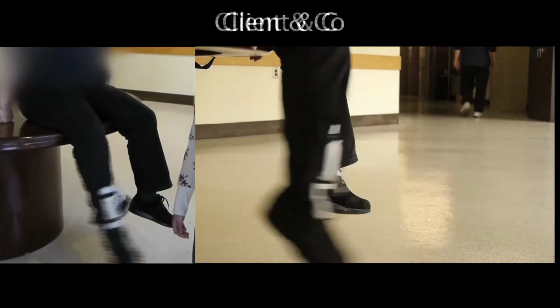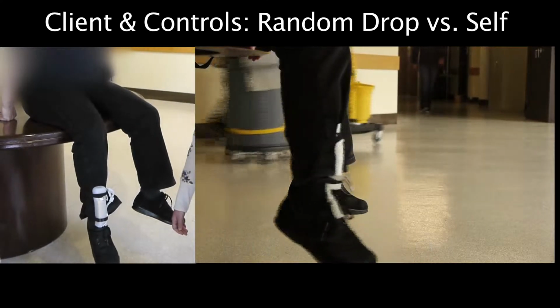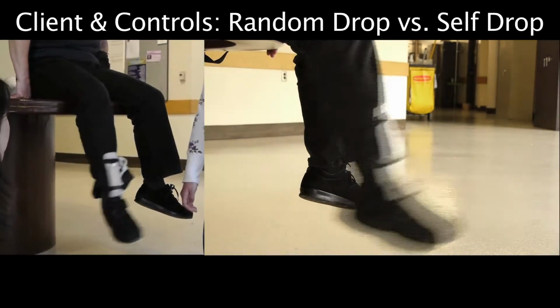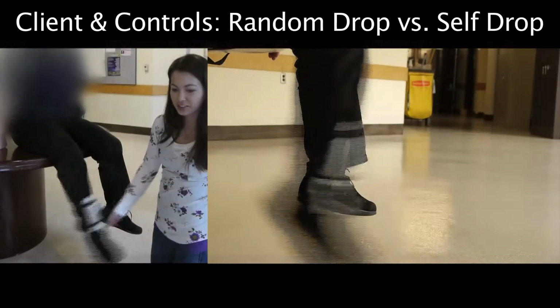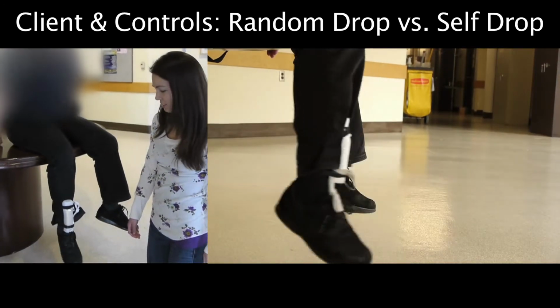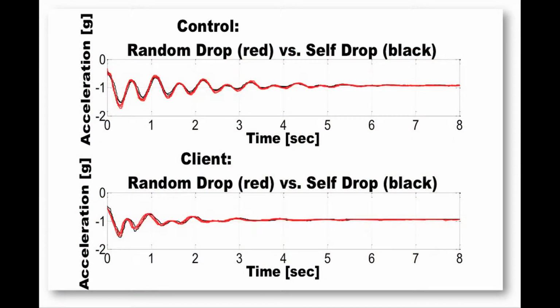Since one of the shortcomings of the pendulum test is that it requires a trained physician to randomize the drop and determine the patient's spasticity, our first design concern was determining whether randomizing the drop was necessary. If it is necessary, then an external device will need to be designed to make the test self-administrable with a randomized drop. From these tests, we were able to determine that the knowledge of when the drop occurs does not affect the results of the pendulum test in either the control or the client.